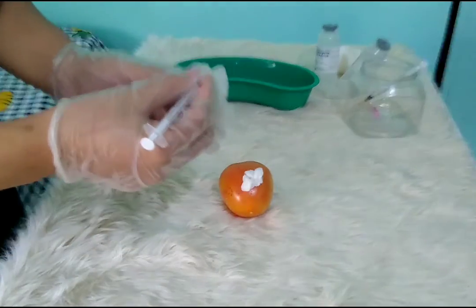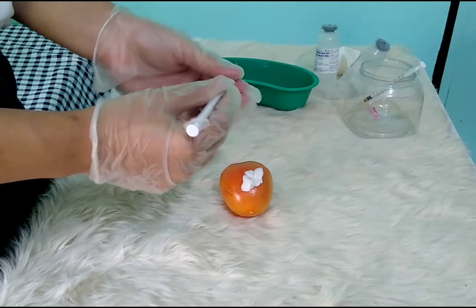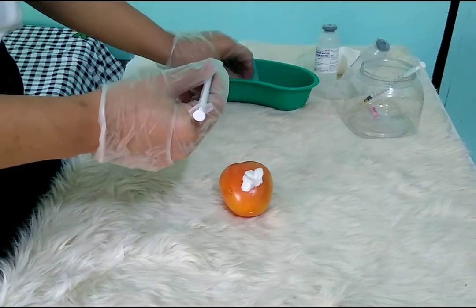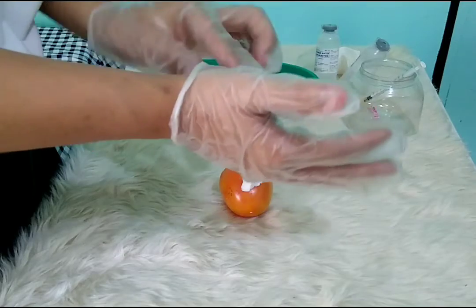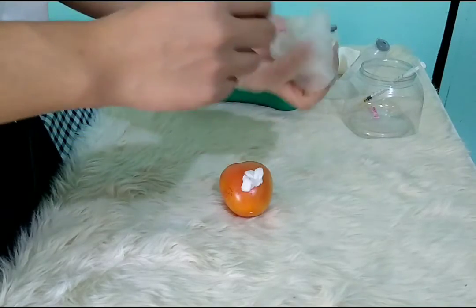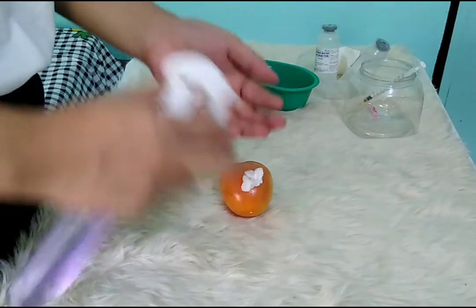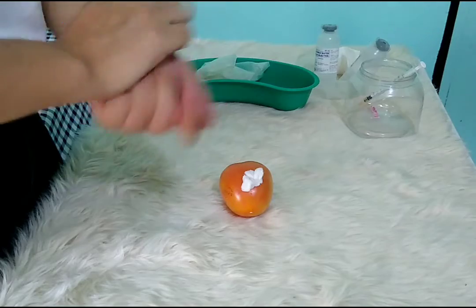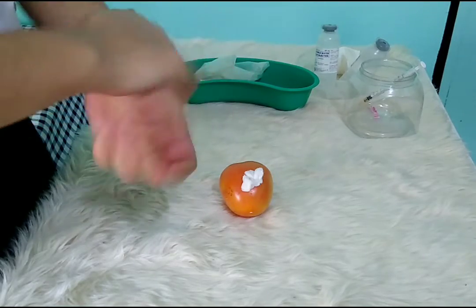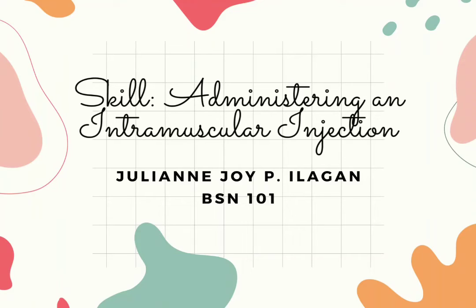And then we can dispose of the supplies appropriately. Activate the needle safety device or discard the uncapped needle and attached syringe into designated receptacles. And now we can remove and discard the gloves. After that, we can perform hand hygiene. Assess the effectiveness of the medication at the time it was expected to act.